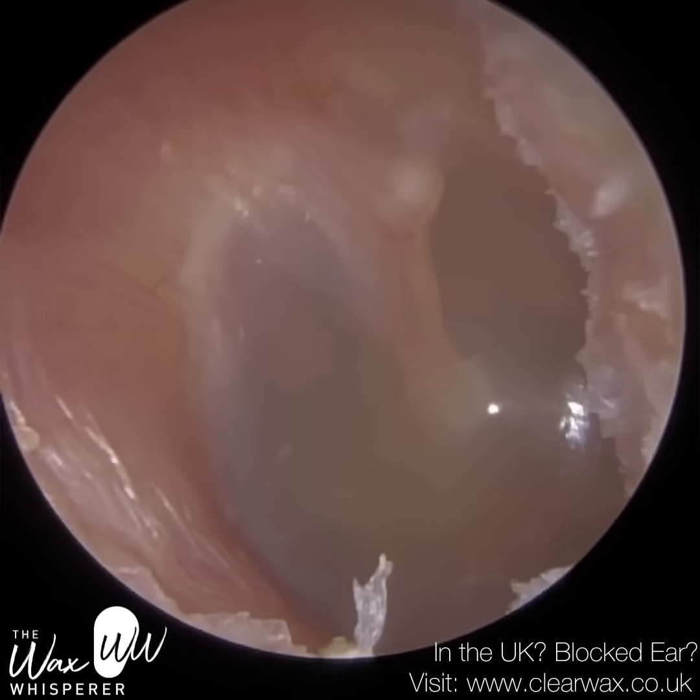The eardrum is nice and healthy, but you can see that skin is macerated underneath — just that sweat and humidity, I suspect. I've written back to the GP; I think it will benefit from another course of antifungal solution drops. The patient knows to avoid olive oil and avoid water, since both of these can exacerbate a fungal infection. Well, I hope you enjoyed that video, guys. Take care, keep well, and speak soon. Bye.